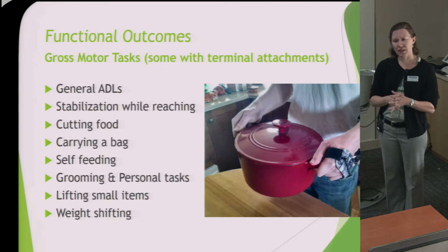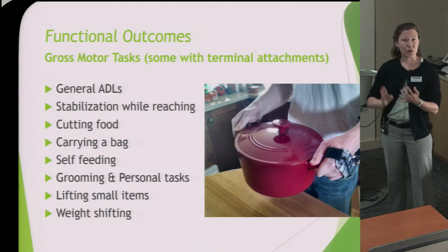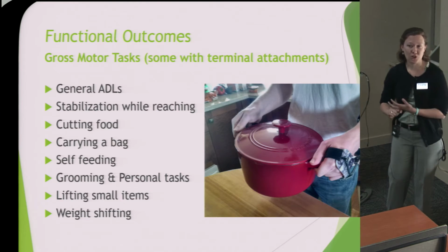But again, we're really looking at, can you be independent in your basic daily needs? Can you pull up your pants? Can you carry a laundry basket to the washer? That sort of thing.